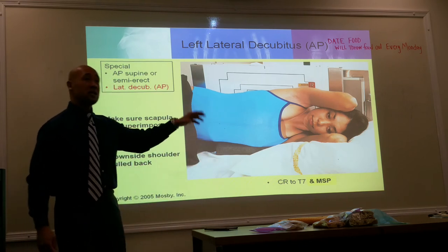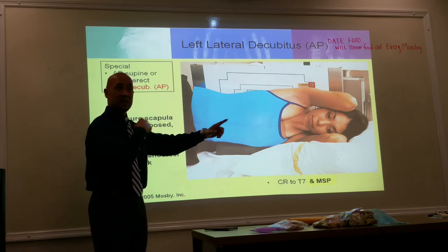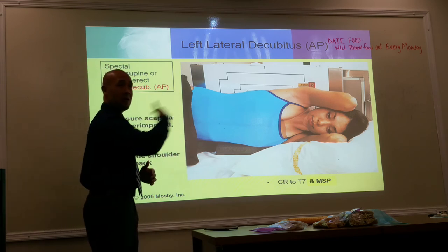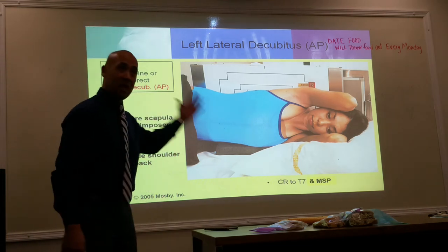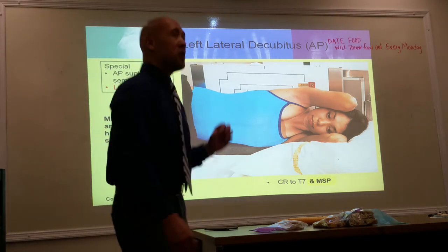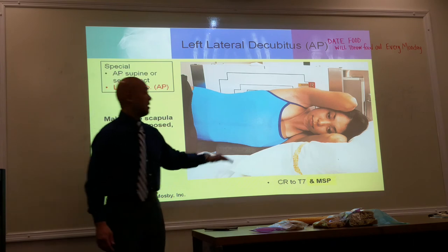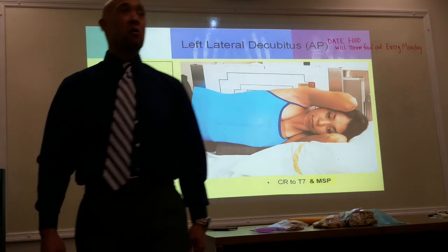But again, you can still accomplish a left lateral decube by which end of the table or the end of the gurney they're on. So it can either be AP or PA. Same thing with the right. You can change it from AP to PA based on what end of the table or bed they're on. But it's still a left lateral decube. It's still a right lateral decube. All right. So if we're looking at fluid levels, we're looking at the side down. So this is a left lateral decube. We're looking for fluid levels on the left lung. Okay? Yes? All right, pneumothorax.